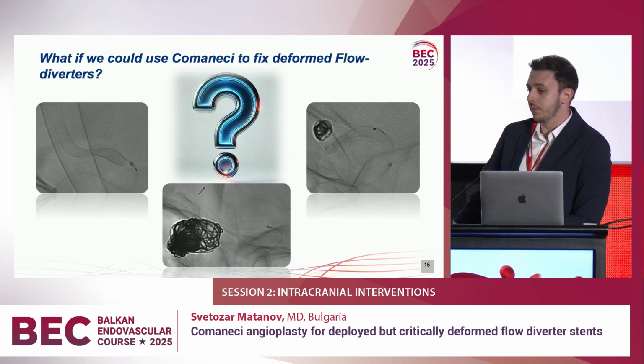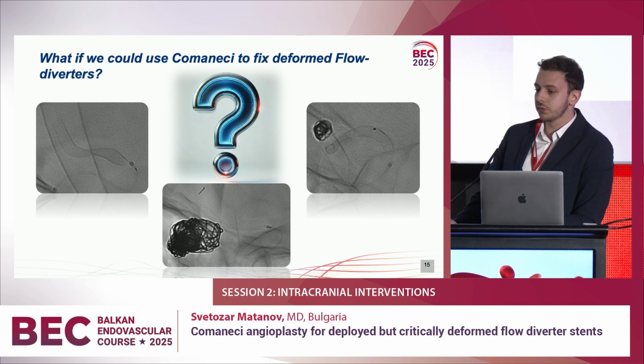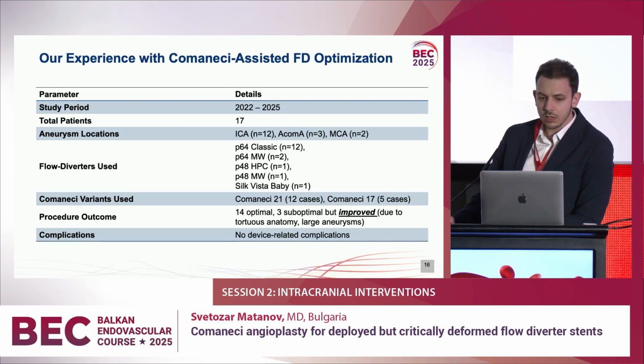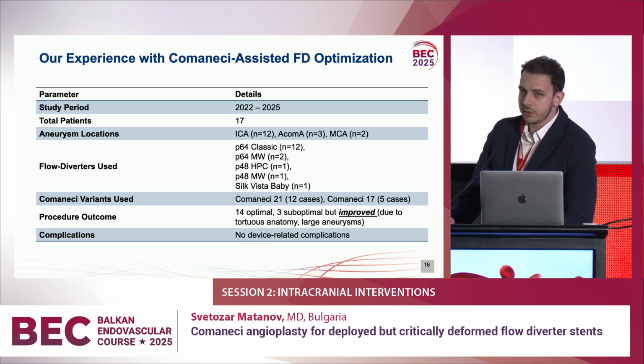So, now, what if we could use the device to fix some deformed flow diverter stents? This twisted one, this collapsed, or this stenotic stent. Before we jump onto the cases, I would like to share briefly our data.